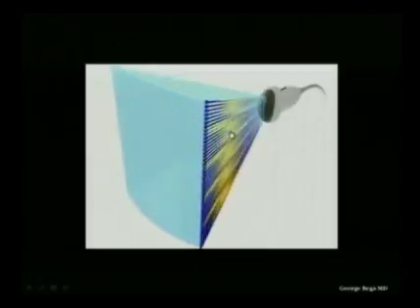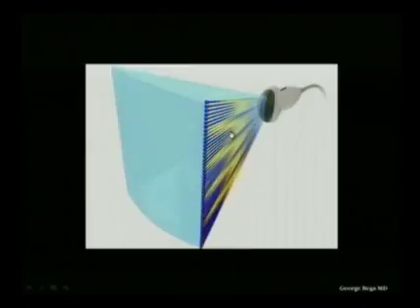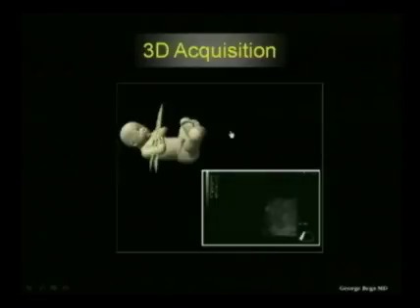So again, here by scanning with these mechanical transducers, you do not have to physically move the transducer elements. The motor will do that for you at a pre-selected speed. You just have to scan over the area of interest and go into an acquisition plane that has been proven to yield the highest number of 2D slices into this volume.